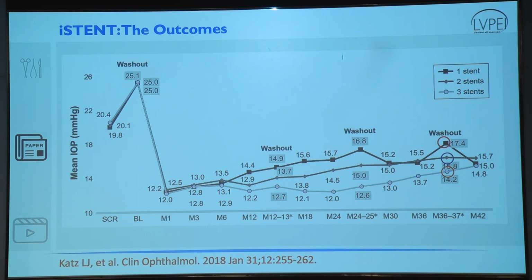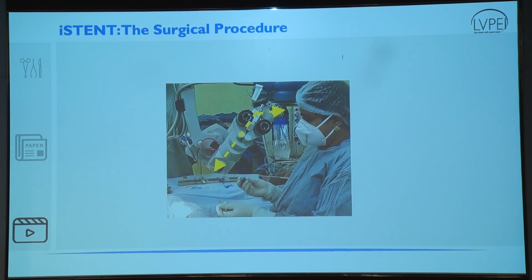These implants do have a place in our practice. Otherwise, we will not be talking about them. The safety of each and every MIGS procedure that we have spoken about is amazing. So let us look at the procedure.